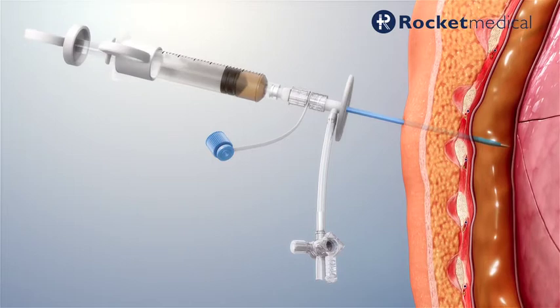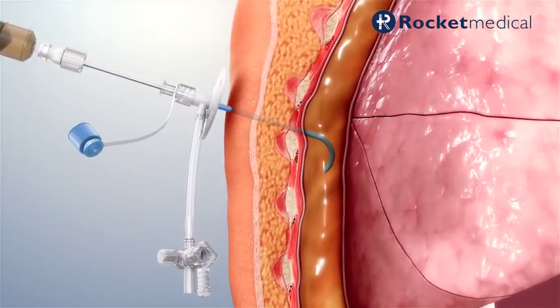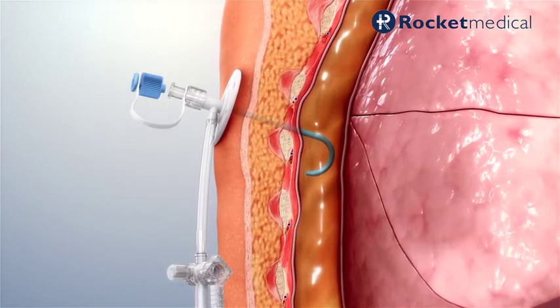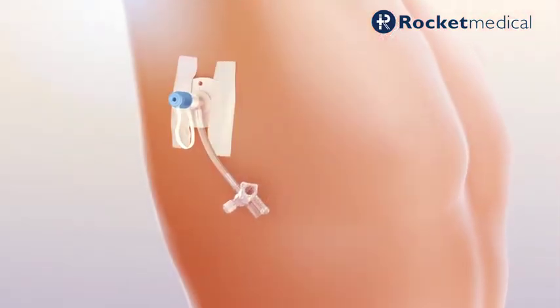Unlock the needle from the catheter and advance the catheter into the pleural space until the fixation plate is against the chest wall. Remove the needle and seal the catheter using the attached sealing cap. Secure the fixation plate.